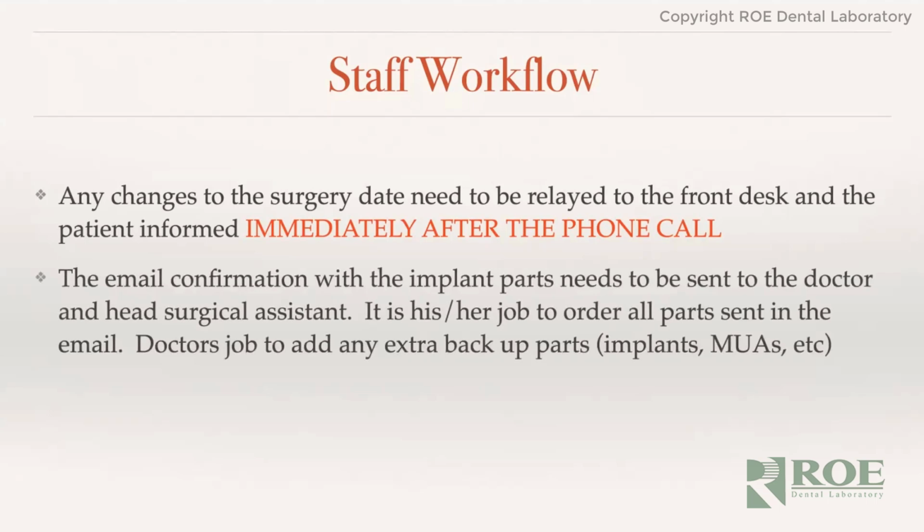The email confirmation with the implant parts needs to be sent to the doctor, and I always have them send it to my head surgical assistant and sometimes my other assistant. It is his or her job to order all the parts sent in that email, and it's our job to make sure that any extra backup parts are present.